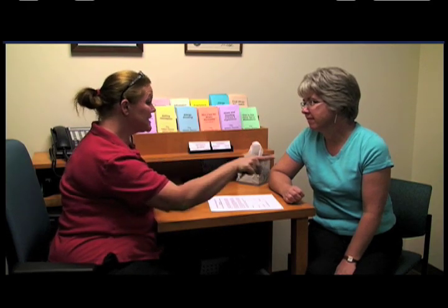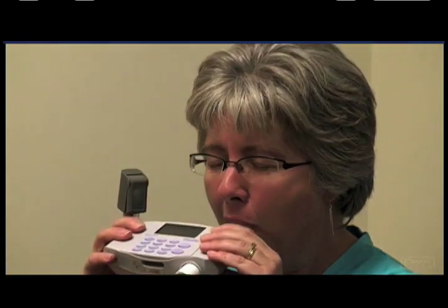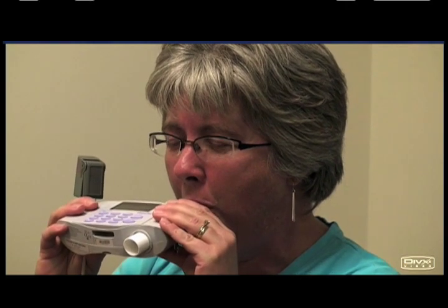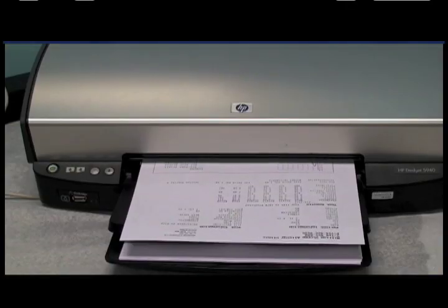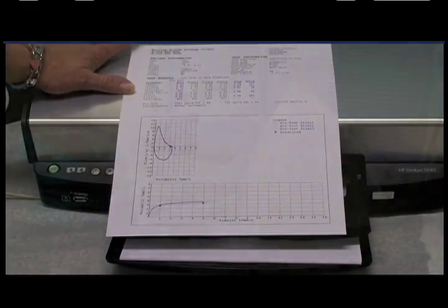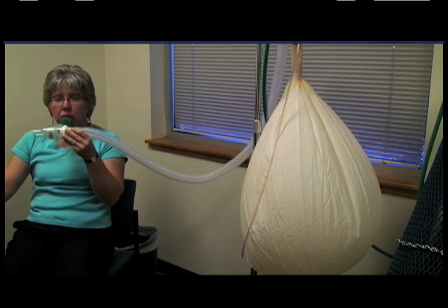As with all bronchial provocation challenges, the EVH test begins with a patient providing a consent. Then the patient is evaluated to assure that he or she is capable of performing the test and that the test is safe to perform. Drug washouts are examined to determine if the test is valid to perform as well. The EVH test should be performed with caution in patients with FEV1 that is below 80% of predicted at baseline and should never be performed on patients in whom this FEV1 is less than 70% of predicted because of the danger of severe bronchoconstriction from the challenge itself.